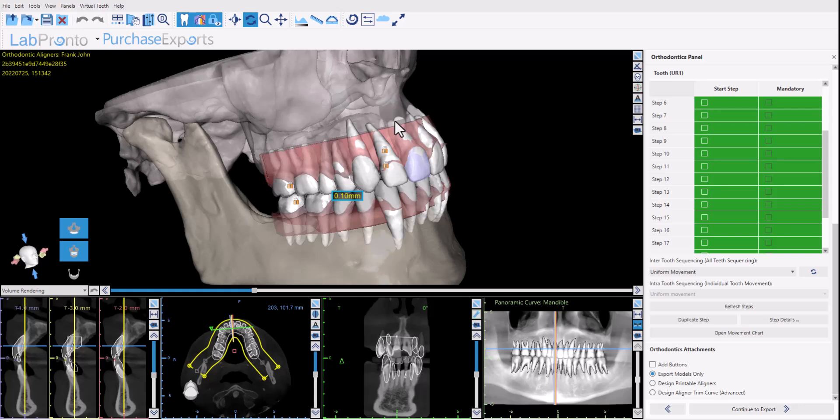I'll also be reviewing connected functionality regarding the ability to add a base for vertical aligner printing as well as other functionalities such as being able to emboss text onto the models, number the models, and other related functionality.